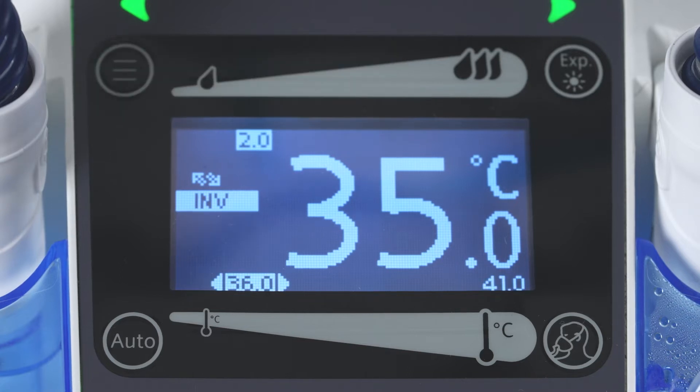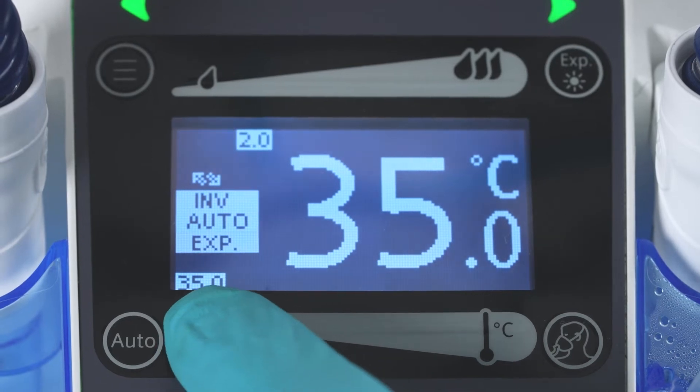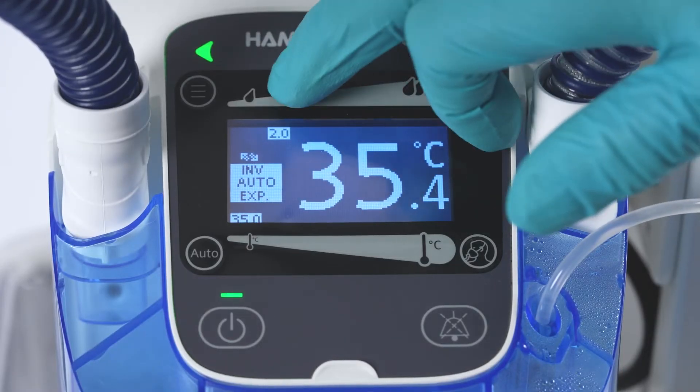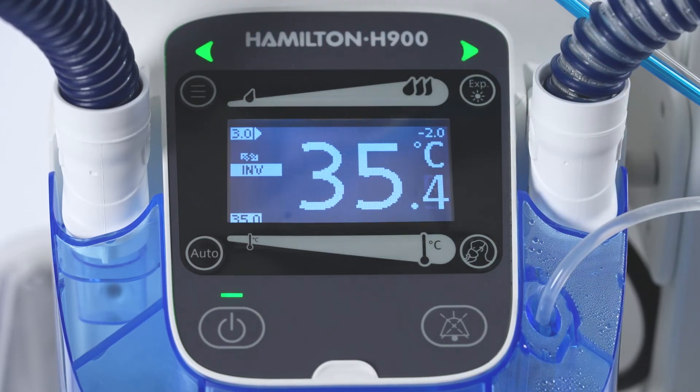You can lower the chamber exit temperature. You can also increase the temperature gradient, which represents the difference between the water chamber and Y-piece temperatures. To do so, long press until a beep sounds and drag the temperature gradient slider to the left.